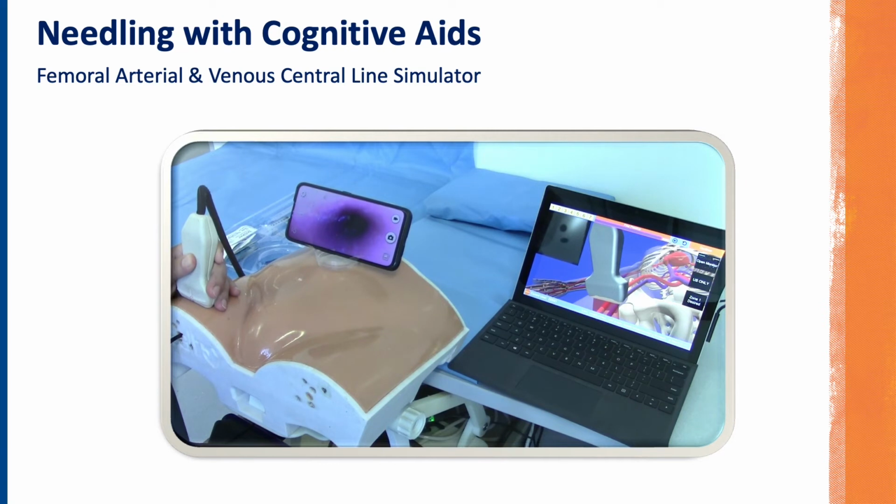In the short axis out-of-plane approach shown here, the long axis of the ultrasound probe is placed perpendicular to the femoral artery, and the needle is observed as a hyperechoic white circular dot on the screen. You can use the tilt, peak, and slide technique to prevent backwalling.